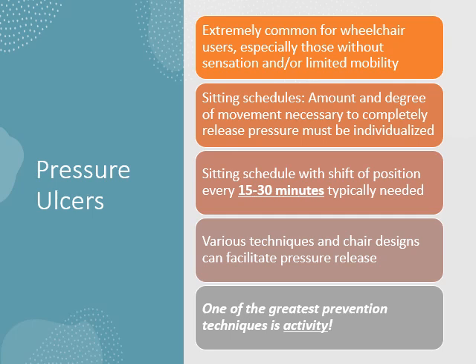But also being active, for the patient to be sitting in the wheelchair but actively weight shifting, so doing various occupations, being engaged in occupations. If they have trunk control and upper extremity control, they can shift their weight adequately. That is the best prevention technique to prevent pressure ulcers from developing in the first place.